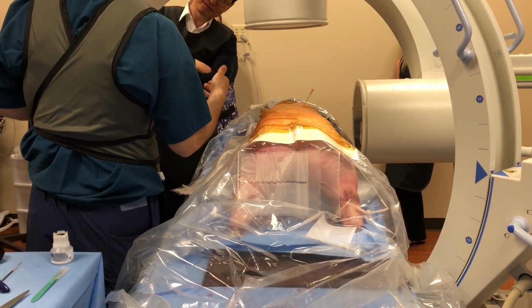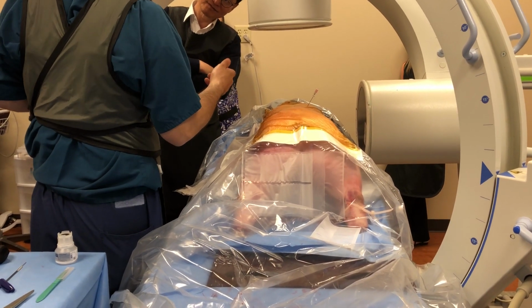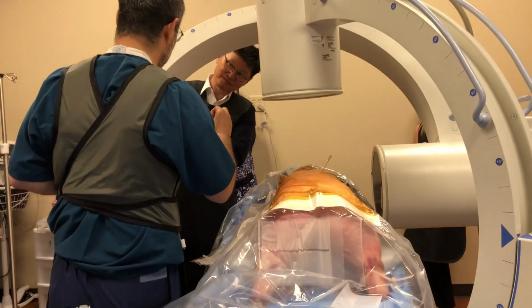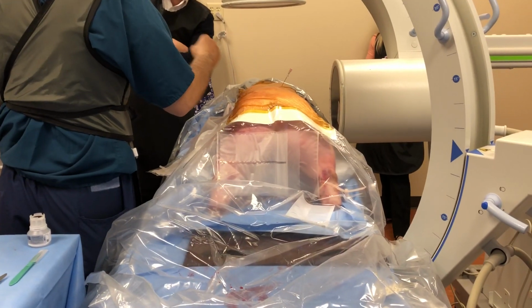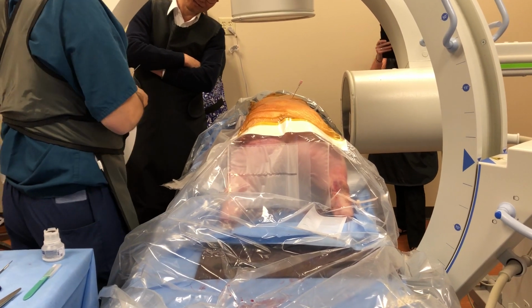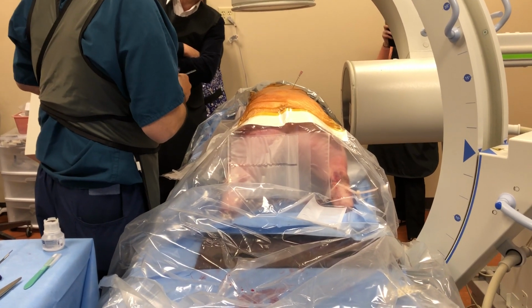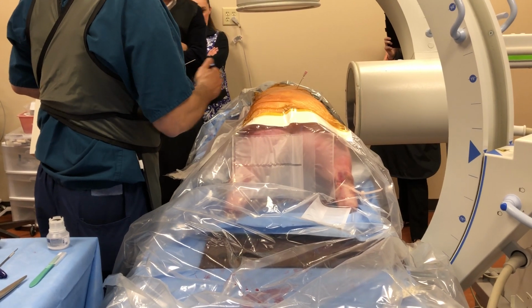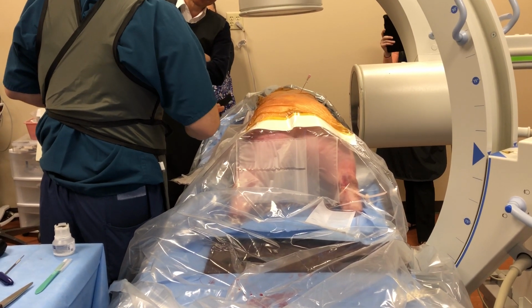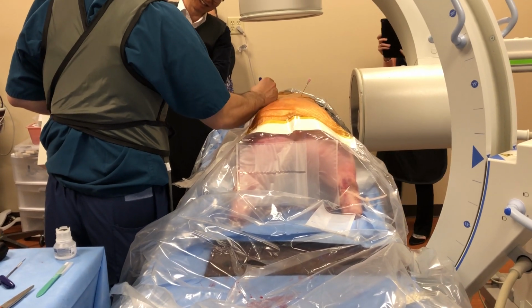Lots of people do far lateral approach for things like schwannoma in the transforaminal pathology or even extraforaminal approach. Then you possibly have to drill the lateral part of the facet and so on, but here, after 700 cases, it has never been a problem. Okay, but if you want to go more straight lateral, then you use this line.